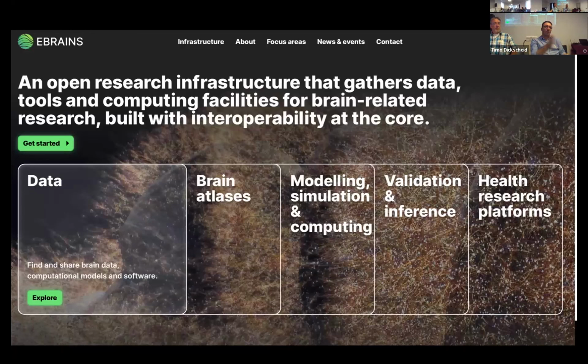Of course, one may ask, is it, and this is, of course, hypothesis driven, because you are already directing the algorithm to a certain region of influence where you expect a border region. And it is also controlled by an expert, right? This also makes the quality of the cytoarchitectonic atlas that we are presenting here.